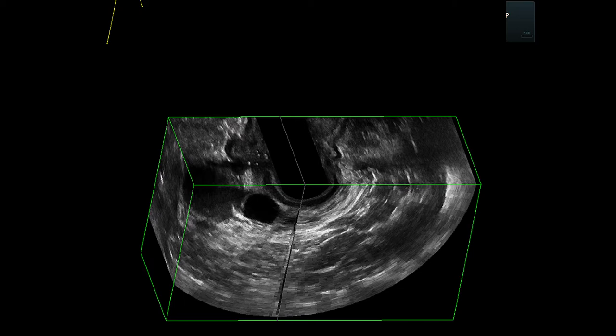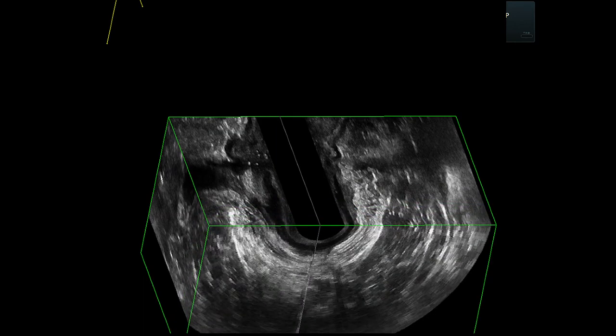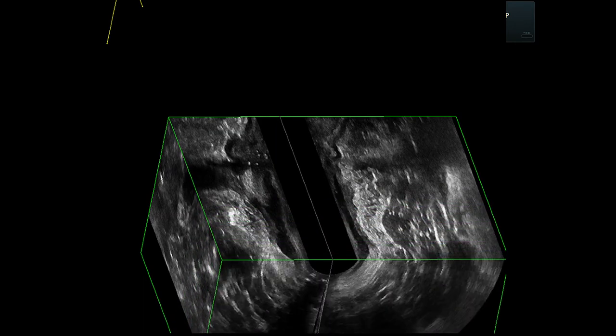Just one question. Can't you make a biopsy? It's a very good question. We did a fine needle puncture. Actually, we couldn't get some material. You should not do a biopsy from inside, because if you know the literature, they say it's better not to do a biopsy and to remove the cyst if you can. And what we did, and it's very easy if you know how to do ultrasound and fine needle from the outside, then the infection rate is as low as possible. And we did that, but unfortunately the material didn't give us any more information. Okay, this is information for the professor.